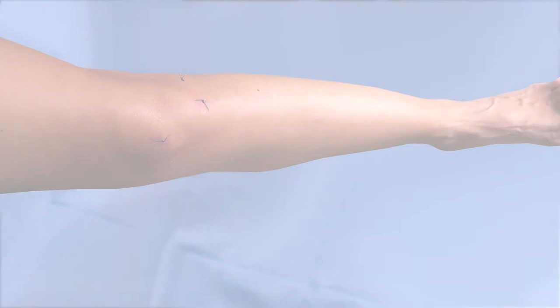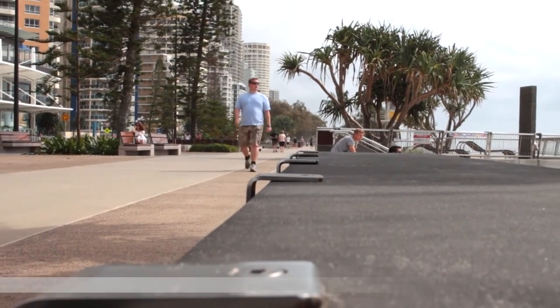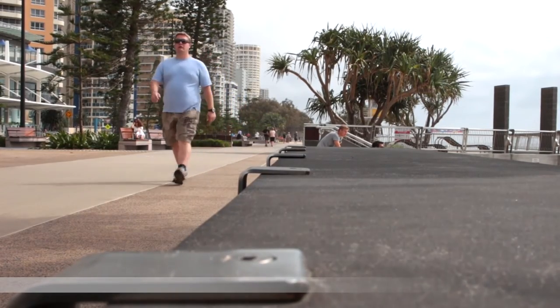After treating your condition, the port incisions are closed by suturing with stitches or with surgical tape. Arthroscopy is proven to be much less traumatic on the muscles, ligaments and tissues than more traditional methods of open surgery.